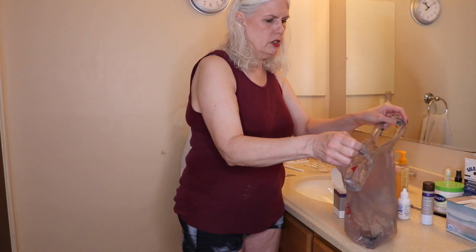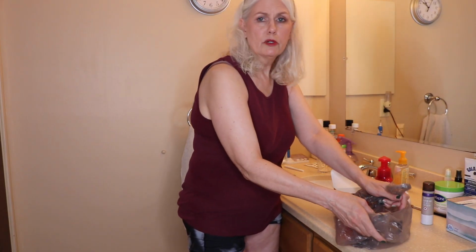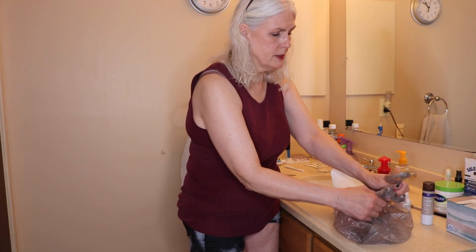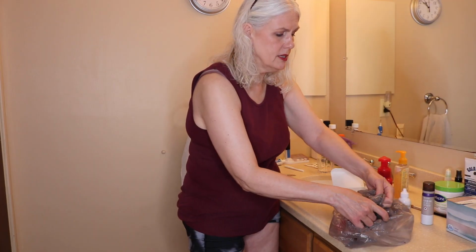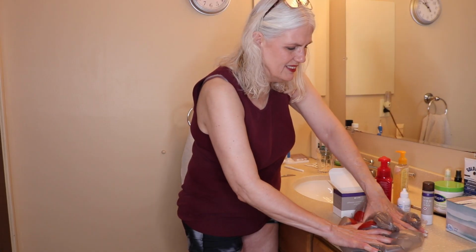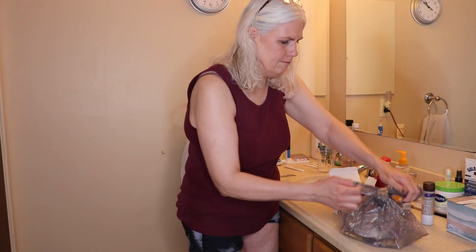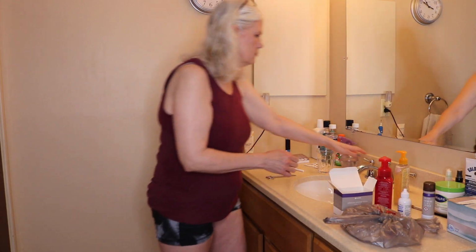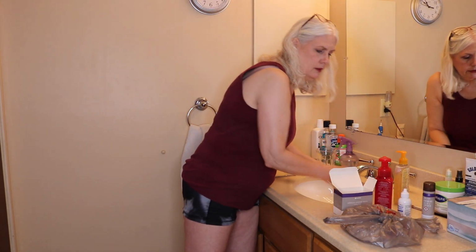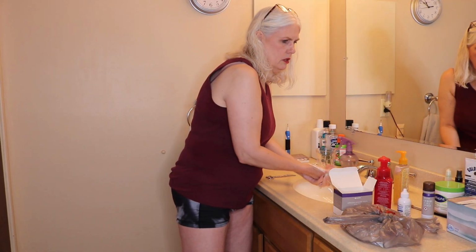This just goes in the regular garbage. As I heard, just like with diapers, if you have dogs, just be careful, make sure everything is well sealed. Make sure it goes into a garbage that's well protected so that it doesn't get gotten into and make a mess. And you wash your hands just like you would if you just went to the bathroom. Just changed everything up.